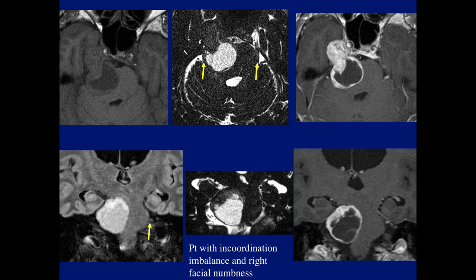Okay, patient comes in with incoordination, imbalance, and right facial numbness. Diagnosis. Correct.